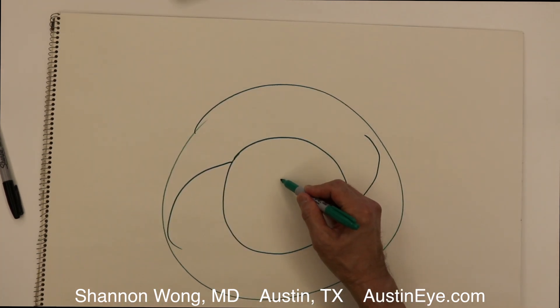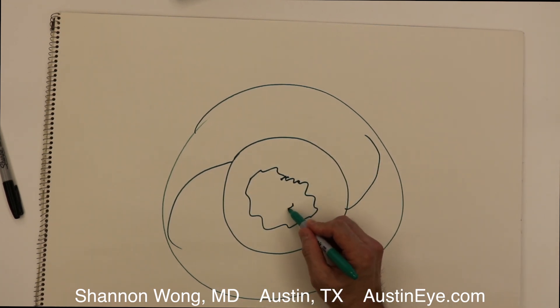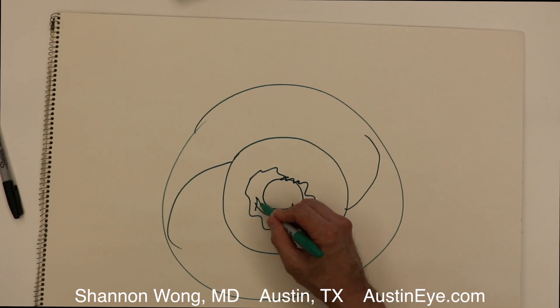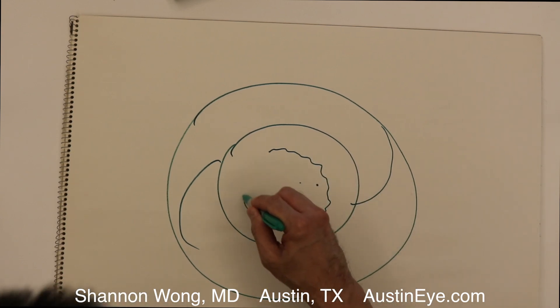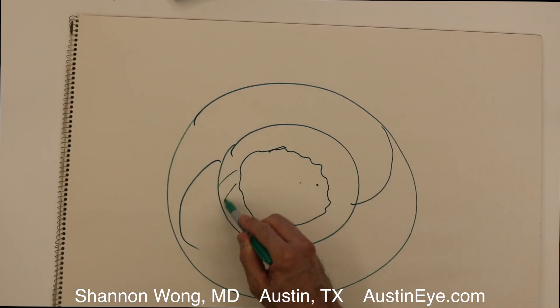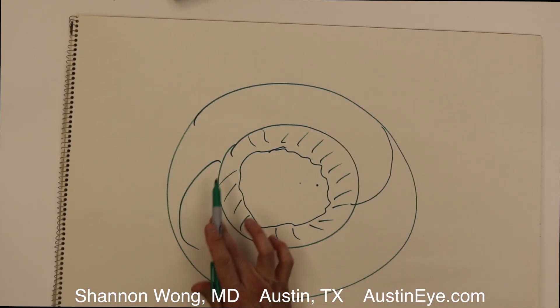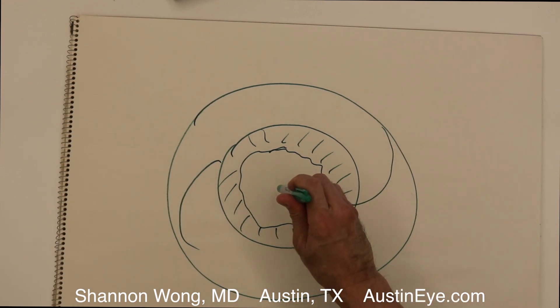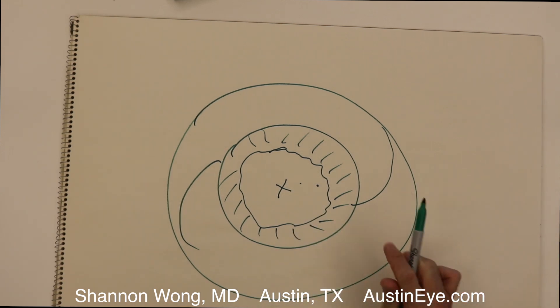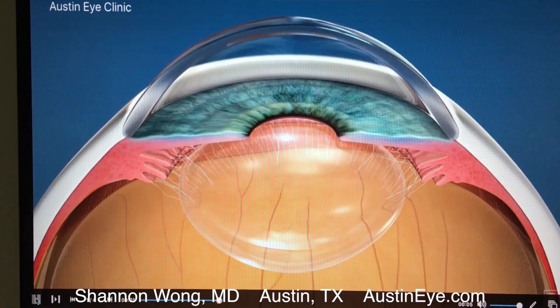The goal is to make the opening about this big, centrally placed, and we kind of spiral around to widen it. When we're done, the patient has a central opening they can see through. The peripheral area is still left untouched — it holds the lens in proper position and alignment so it doesn't move, but the patient is able to see through the middle without their view being obstructed by the cloudy film.